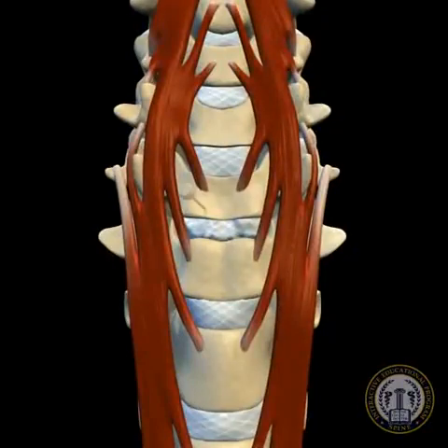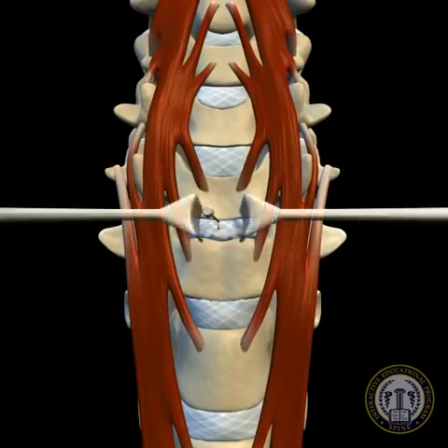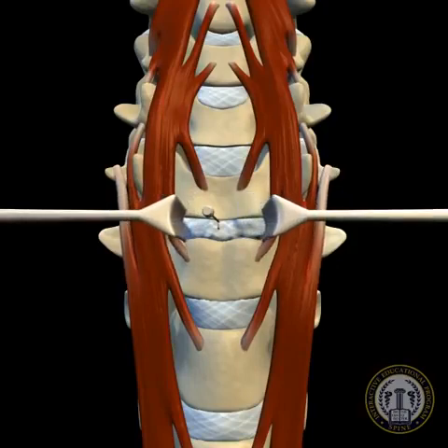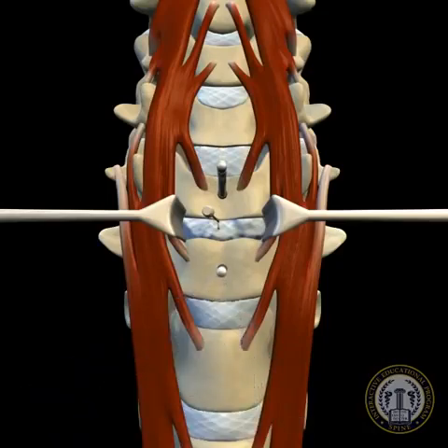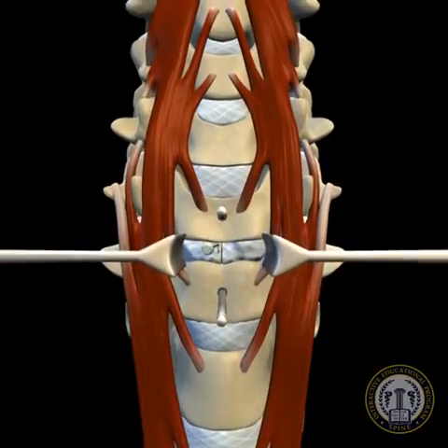A disc space is marked with a bent needle to accurately determine the appropriate level for planned disc replacement. Once the appropriate level is identified, blade retractors are placed under the longus colli muscles, and distractor pins are placed into the vertebral bodies above and below the diseased disc. At this point, the disc is incised and disc material is completely removed.